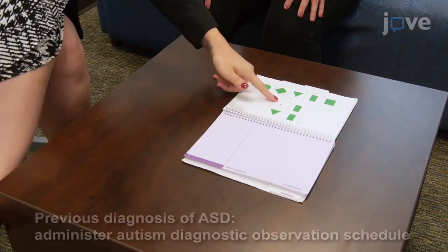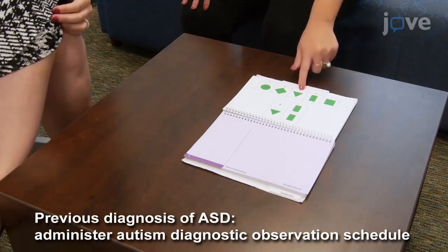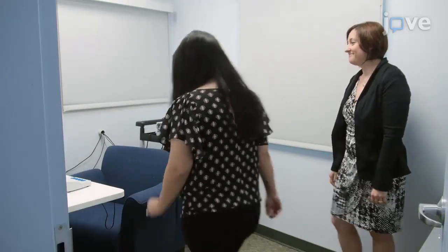Begin by escorting the participant into a testing room. Administer cognitive tests to the participant to confirm that the child has a cognitive score within the low average to average range. Next, if the participant is eligible for the study, escort them into the testing room.